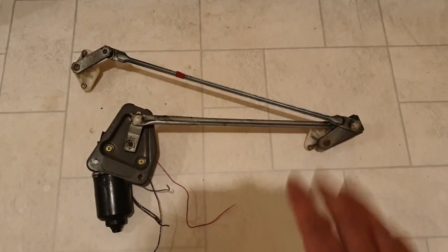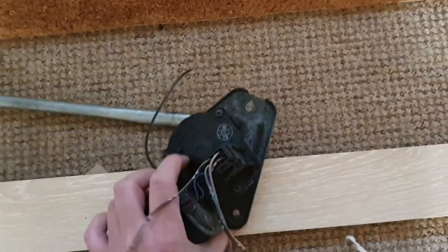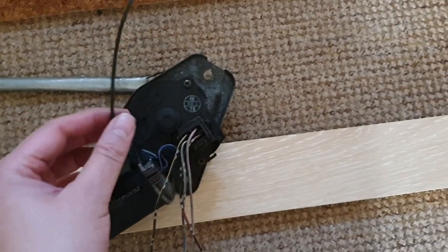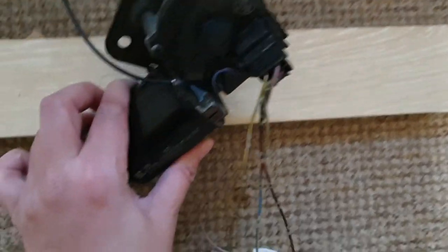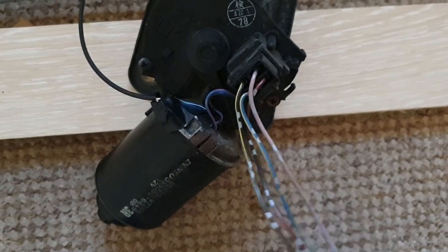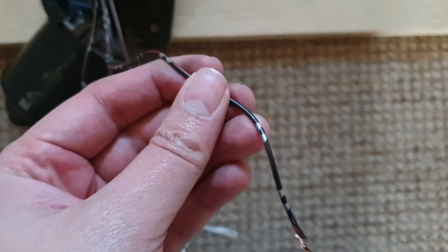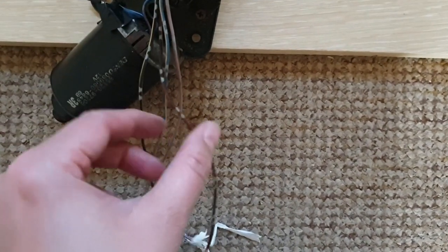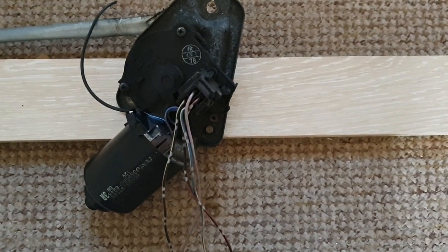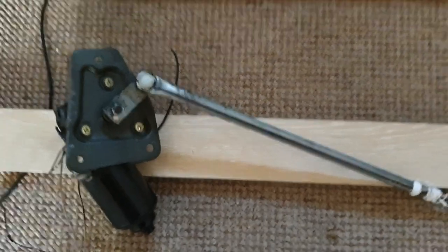Here's the view of the motor assembly with the additional linkages removed. Turning it around, you'll sometimes find four wires and sometimes five. If there are just four wires, you'll need to manually attach a negative terminal wire, as they are normally grounded to the body of the motor. Within these four wires, one makes the motor turn slow, another makes it go fast — we want the slow wire. The remaining two wires make the motor return to the parking position; we won't be using them, so just ignore those and pick the wire that makes the motor turn slow.